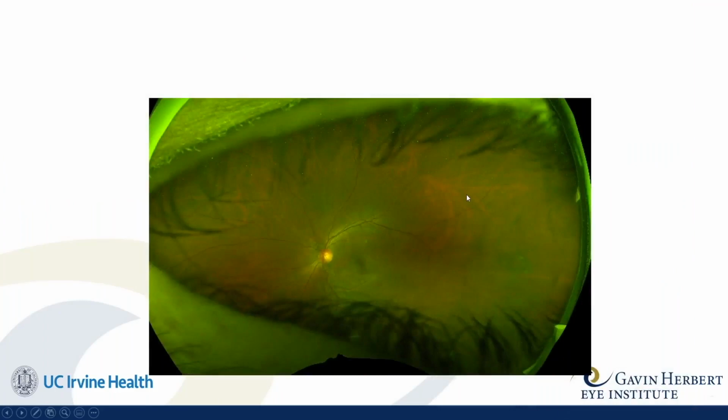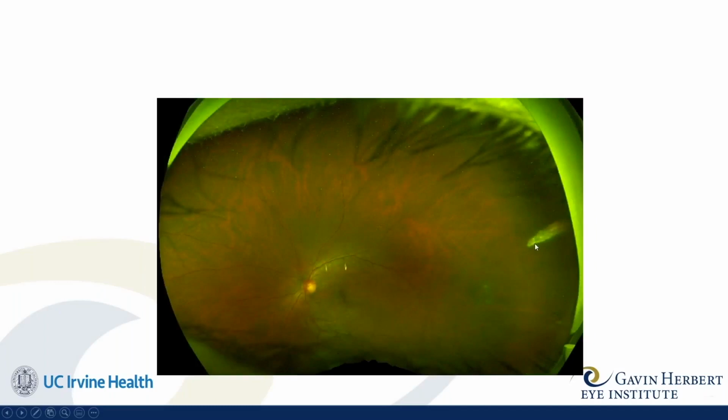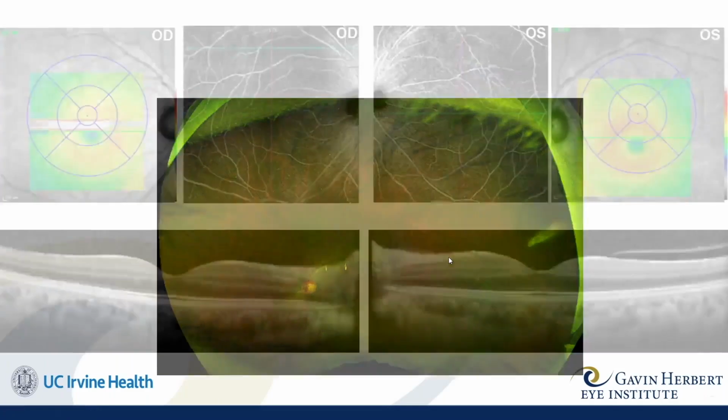A wide field pseudo-color fundus image looks fairly normal, but hiding over here in the far periphery, there's something that's sneaking. And if you had to look in that direction, you can actually see that there's almost like this stake-like structure sticking into her vitreous. And she actually had some small vitreous opacities that were visible as well.